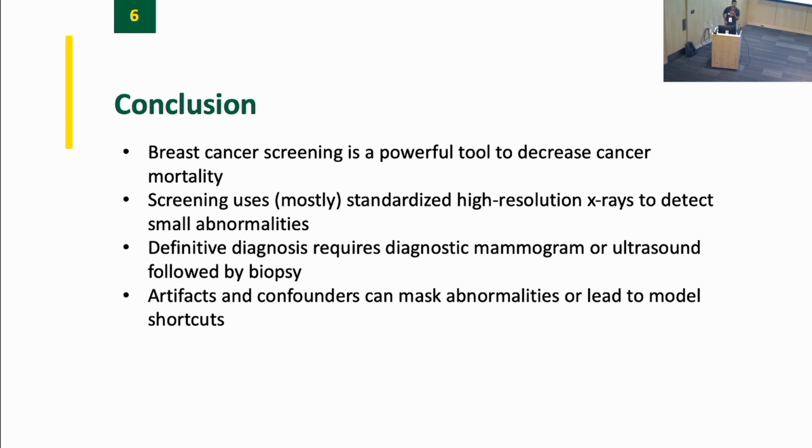It's both cost and feasibility. A breast MRI takes 30 to 45 minutes plus the time to position the patient. So a single breast MR machine, you can probably do 10 or 12 breast MRs a day. Mammography centers typically do about 250 patients a day. So there are not enough MRIs in the world to screen women on MRI. That's a very simple answer.